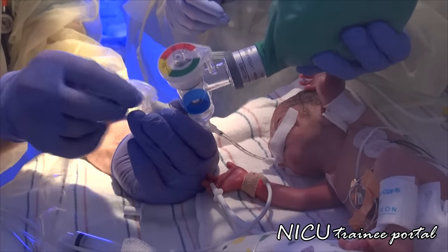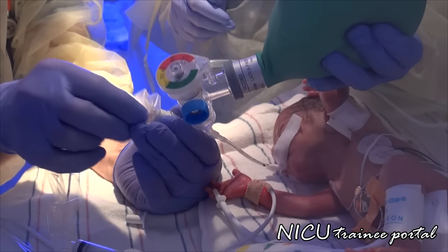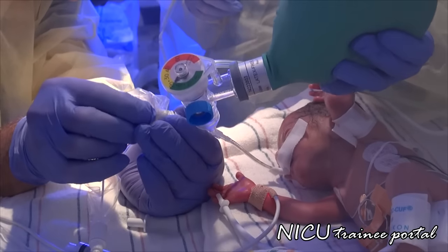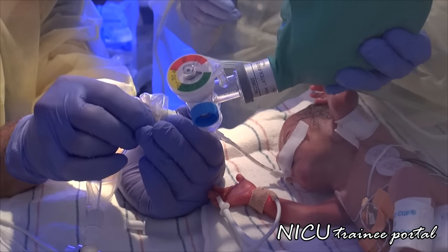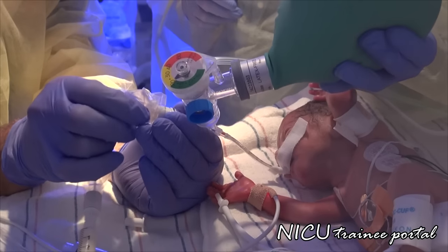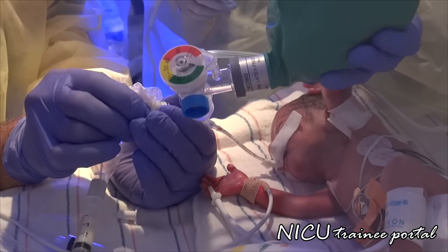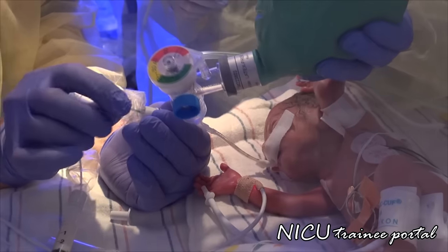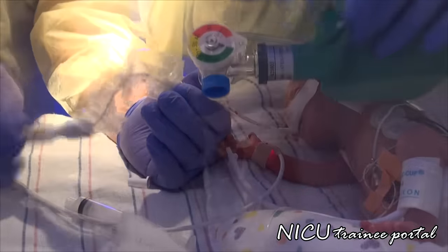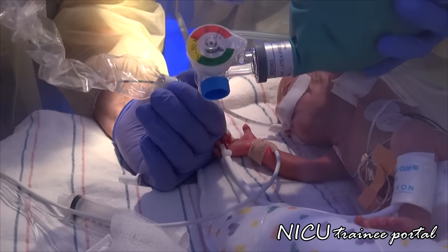The team confirms they will keep bagging through the whole procedure. The provider administering will hold the bag throughout. They proceed to give the first half-dose aliquot of surfactant, with the team continuing to bag.